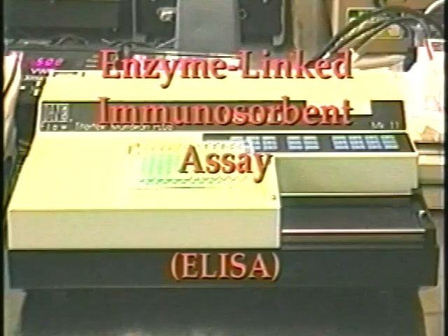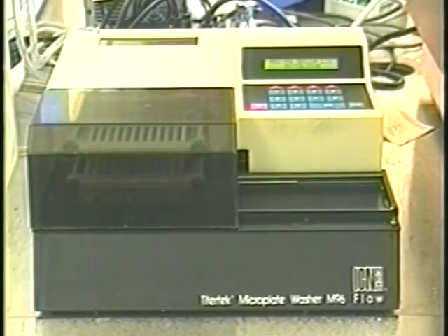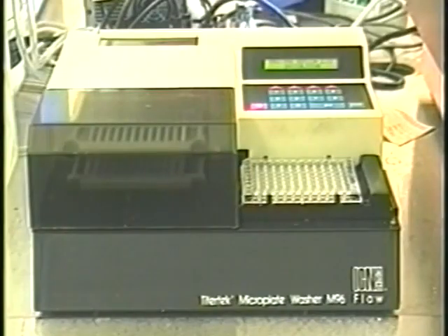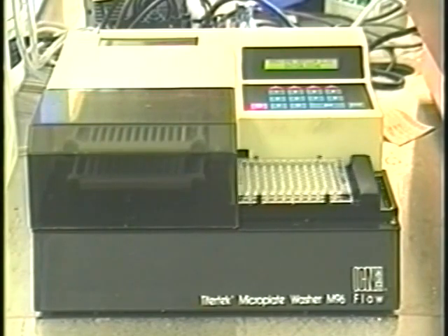The ELISA procedure usually requires that tissues be collected and frozen or processed immediately to preserve antigens. The ELISA is an extremely sensitive technique, and as with the other serological procedures, there are many variations. In general, specific antisera is absorbed onto the wells of a 96-well plate. Tissue collected from the fish is emulsified to release the bacterial antigens, and a sample of this is added to the well and incubated. After unbound antigen and tissue are removed by washing, an antibody enzyme conjugate is added.